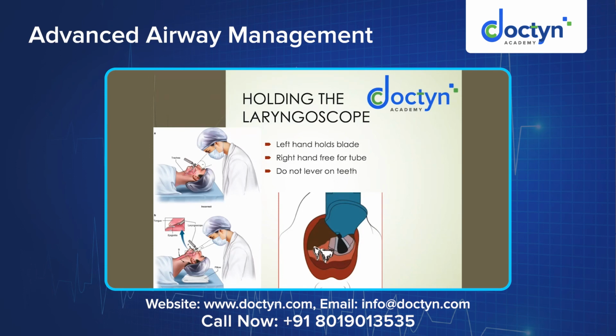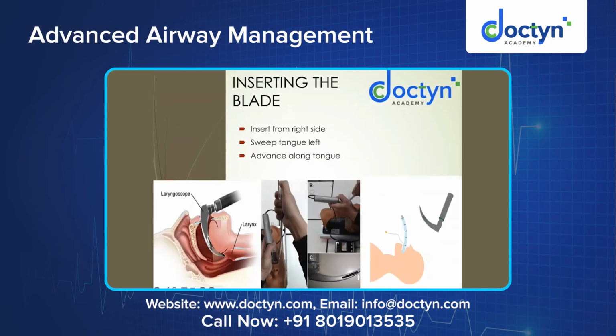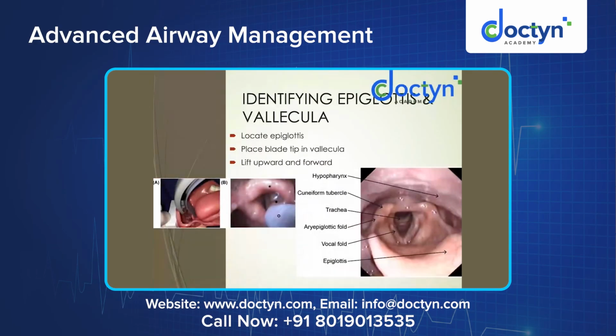So that's why you have to hold the laryngoscope with the left hand, insert it from the right corner of the mouth. The laryngoscope has that provision to include the tongue in that blade. You just move it across to one side, right, and lift. Once you lift, you will be able to see the epiglottis. Once you lift the epiglottis, you will see the vocal cords.